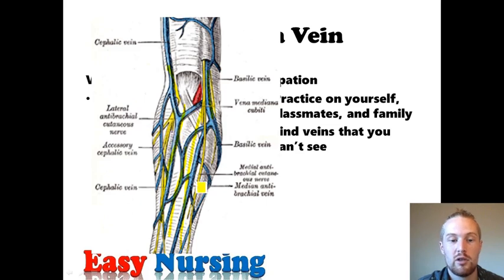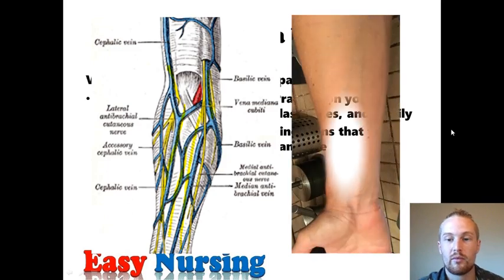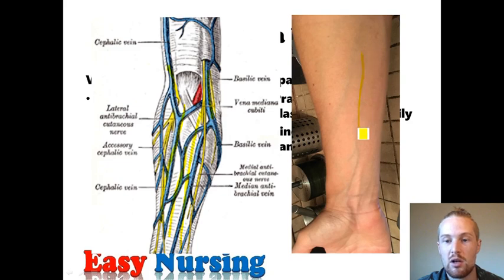Okay, so when I go to start an IV, typically I'll be looking, if you see here, there's going to be some nice, long, straight veins running down the front part of the forearm. You can see you should have some nice AC veins here as well. And then you're just going to see lots of these little tiny veins around the wrist. This is typical in every spot.